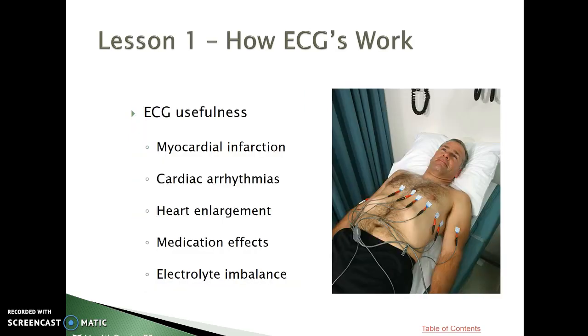Okay, so why do we use an EKG? Well, we do EKGs on patients for several different reasons, but EKGs can detect all of these things: myocardial infarction, cardiac arrhythmias, heart enlargements, effects of medications on the heart, and then electrolyte imbalances.